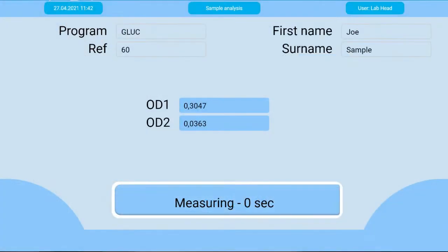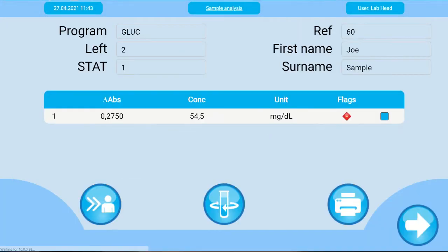A summary of the results will be displayed. You can see the measured absorbance value and the calculated concentration with the unit. Concentration values outside of the reference range are flagged with the plus or minus signs.